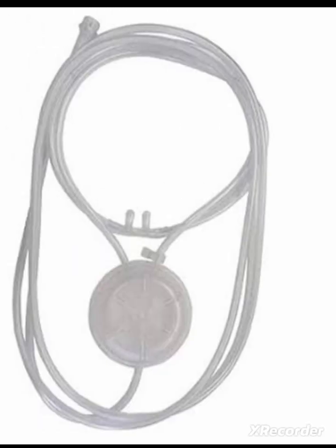Next one, oxygen conserving cannula. You can see that a reservoir bag is connected along with the O2 cannula. This cannula has a built-in reservoir that increases the O2 concentration delivered and allows the patient to use a lower flow.